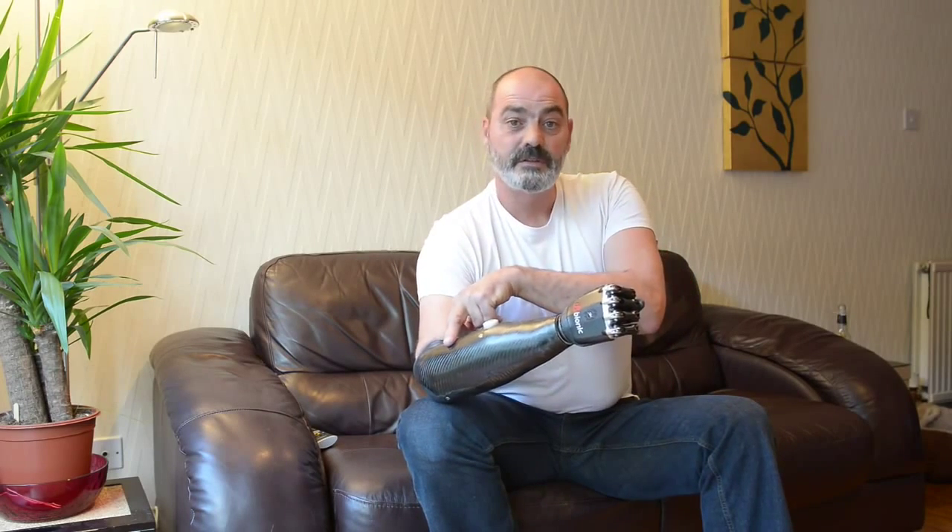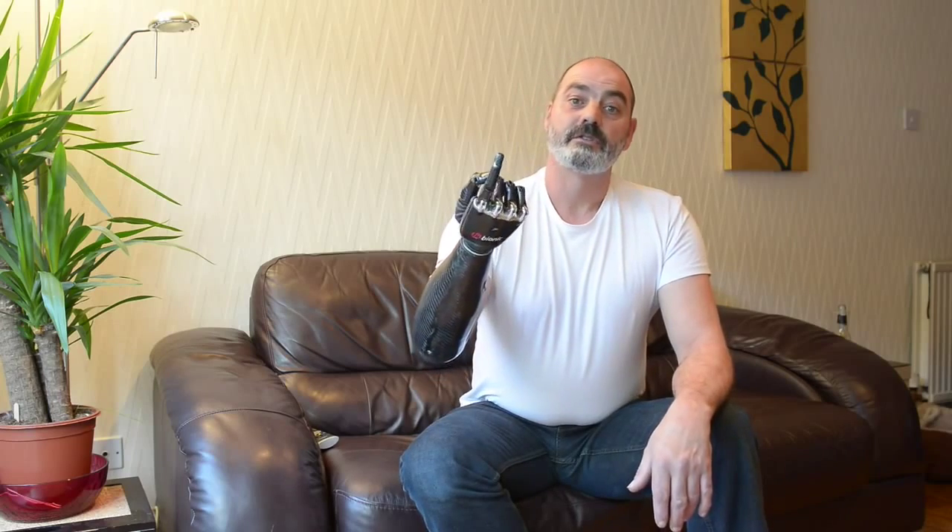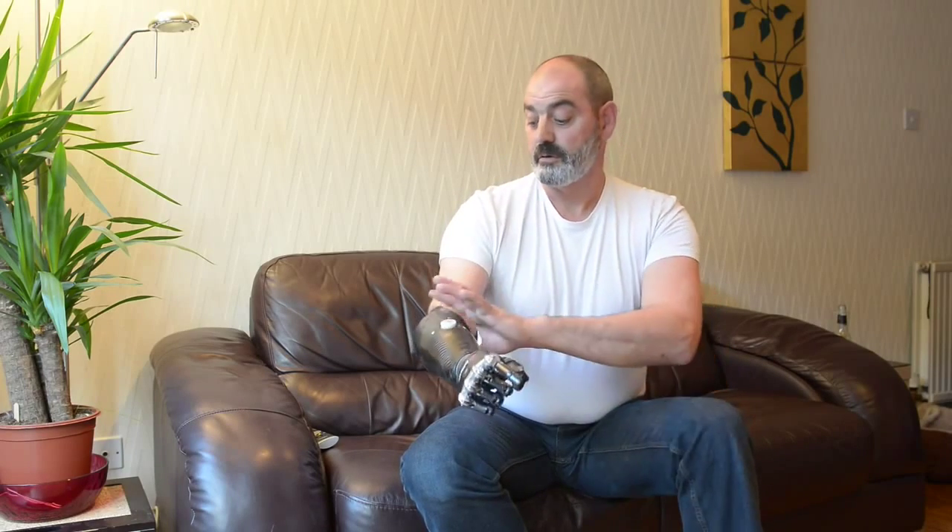If I activate this sensor, the hand opens. Activate this one, the hand closes. It's got eight pre-set patterns which I can use throughout the day. I can move the thumb to give me point grips. I can tie and it has a wrist on it. This is all controlled purely by two muscles, one on the outside and one on the inside of the arm.